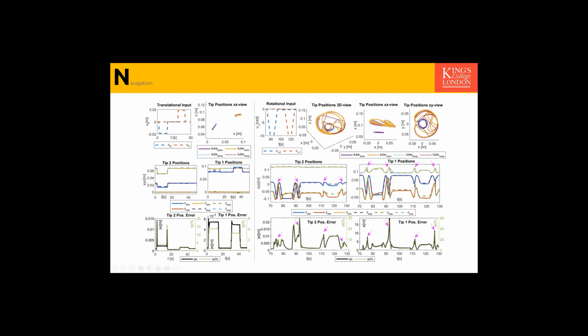So you see actually a slide. So these are the instances of the snapping. We needed to have artificial damping during the snapping to guarantee the simulation convergence and kind of guarantee the real-time performance of the simulation. So although we could predict the start of the instance of snapping, we usually had a slower transition through the snapping as a result.